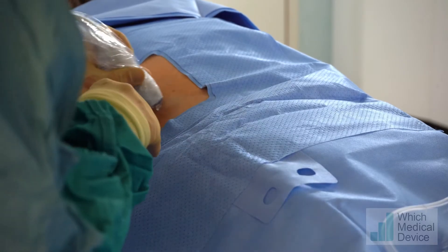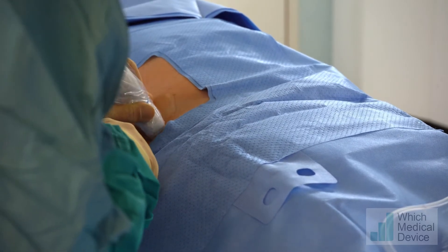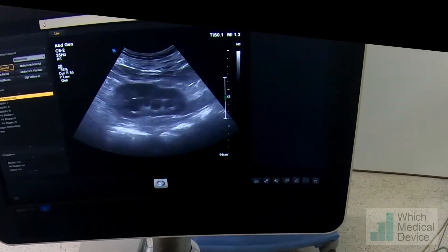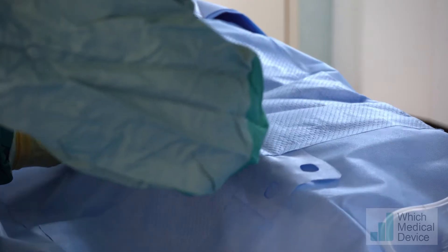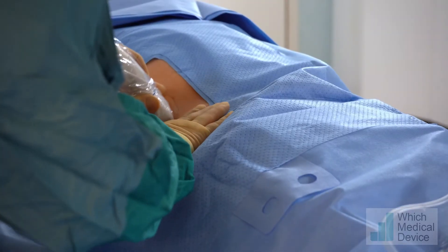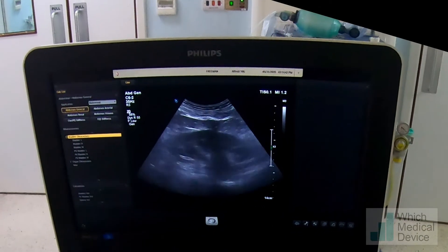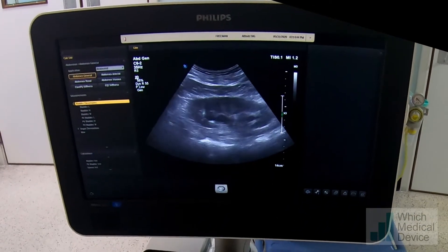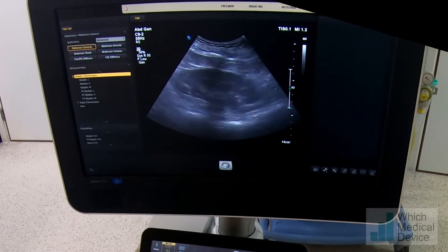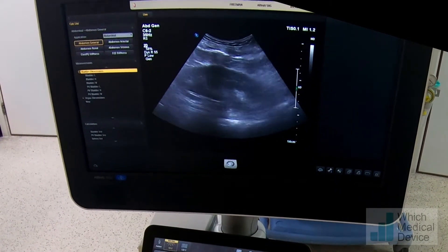We're going to look with ultrasound first at the left kidney, and we've got a moderate hydronephrosis. I'm going to pick the calyx which is most convenient and closest to the skin. It's sometimes an upper pole calyx, sometimes interpolar, sometimes lower pole. I'm pressing with my finger there, so I'm probably going to go for the calyx that's just second from the bottom.